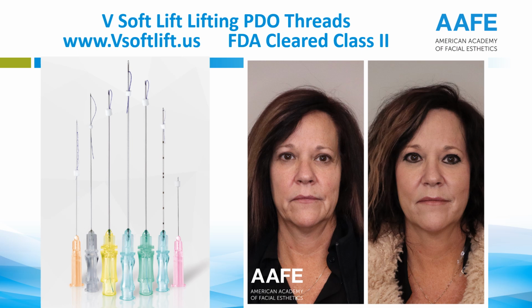These are what lifting PDO threads look like. This patient, the only treatment she had so far in this before and after was lifting PDO threads. She came in for that first, before Botox, before fillers. She hated those jowls. She said, I want to fix that first. She didn't know anything about any of the injectables, and that's what she started with. So that's purely lifting PDO threads. You see what kind of result you can get. She will take far less filler than if you hadn't done lifting PDO threads. Botox will probably be pretty much the same.